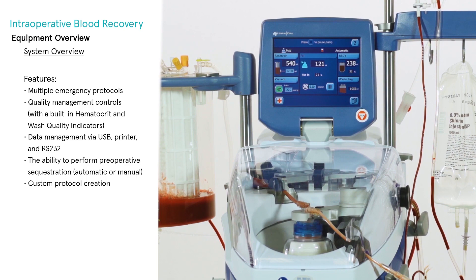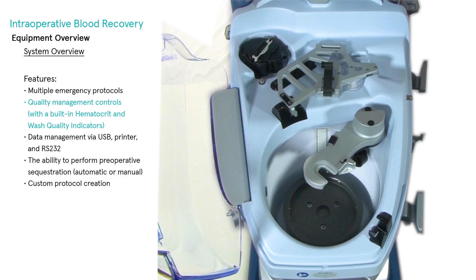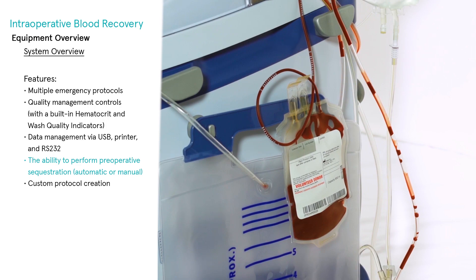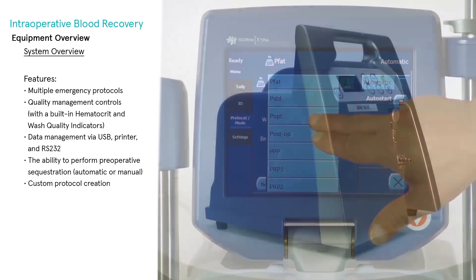These features include multiple emergency protocols, quality management controls with a built-in hematocrit and wash quality indicators, data management via USB, printer, and standard RS-232 computer port, preoperative sequestration capability — automatic or manual — and custom protocol creation.